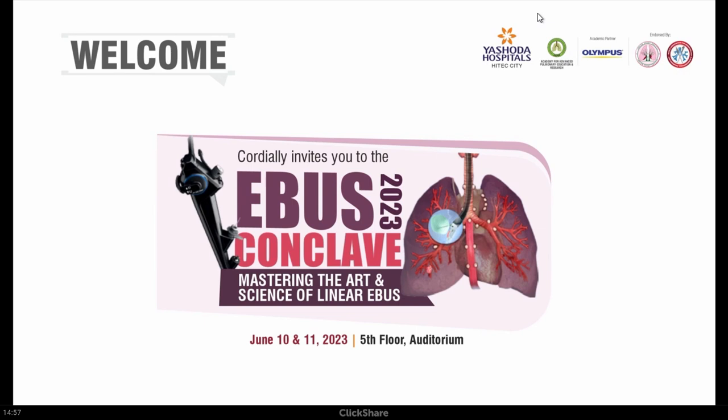Two things we ask. If the pathologist says it is granuloma, clear cut, then there is no need for any biopsy. If the pathologist says it is malignancy, then we ask for the cellularity. We are lucky to have a pathologist who can also comment on the adequacy. If they say that there are very few scattered atypical cells, then you would require more material. If the pathologist says it is malignant and good cellular, then we don't need a biopsy, we just take a cell block. We take 3-4 more passes in the cell block and we are done.